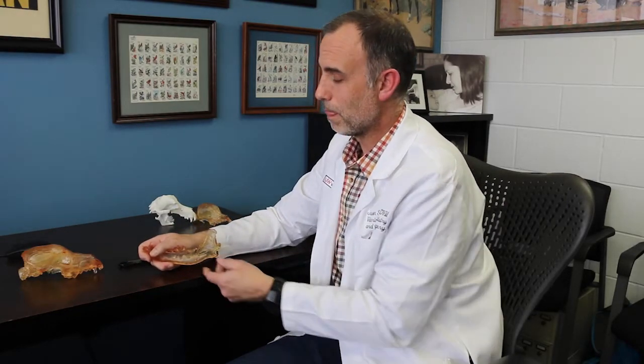One of the great advantages of this computer modeling software we use and the 3D printing is if we have a patient that has, for example, a broken left jaw, we can actually in the software model the patient's right mandible, the opposite side, and then in the software we can create a mirror image of that opposite mandible so that it mimics the left side.